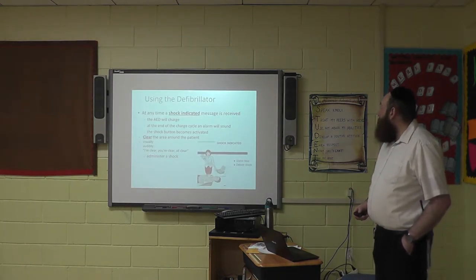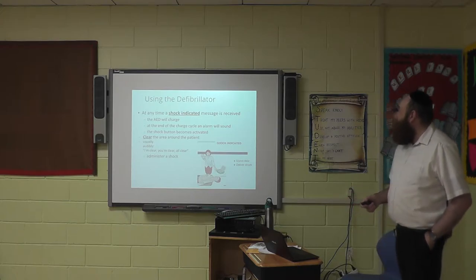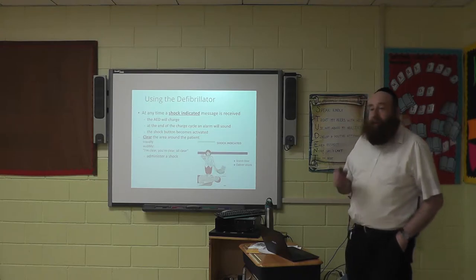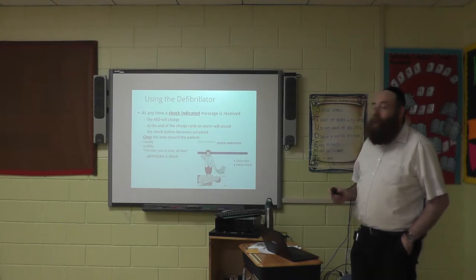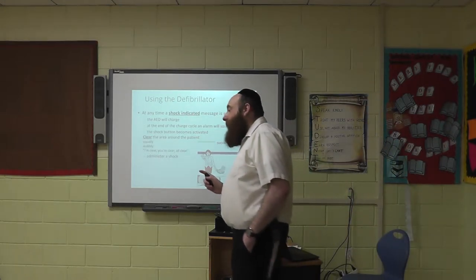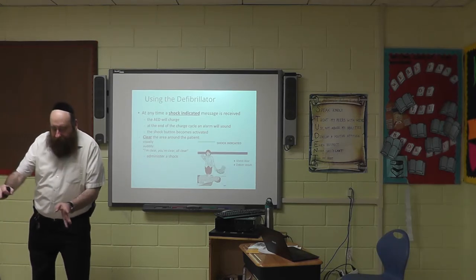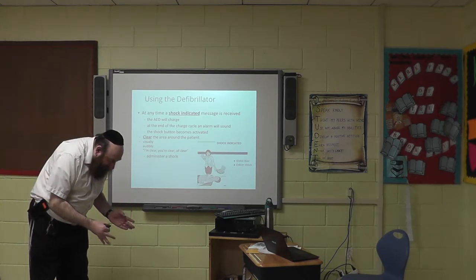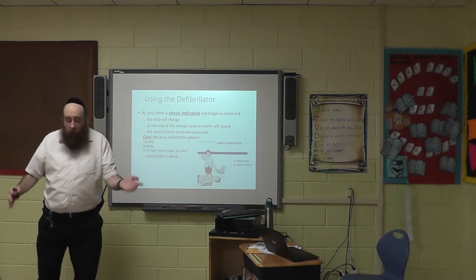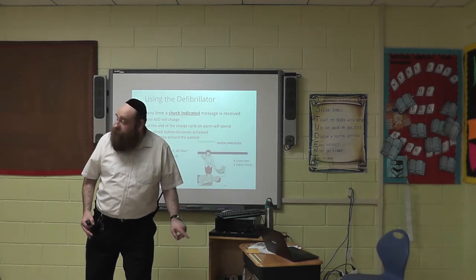Okay, good. We've got somebody actually doing CPR. Now she wants to defibrillate. This is very good. I like this picture. Let me explain why. Because she's not looking at the defibrillator. This is a mistake a lot of EMTs make. They find the defibrillator, they put the pads on, and then they focus down on the defibrillator and forget about the patient. So you want to find the button, put your finger over it.